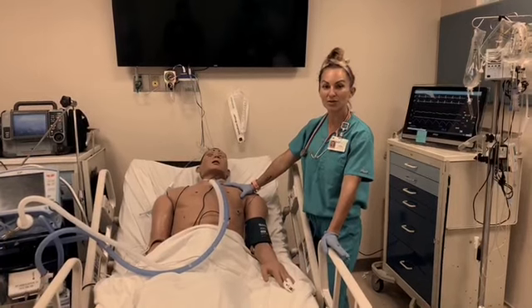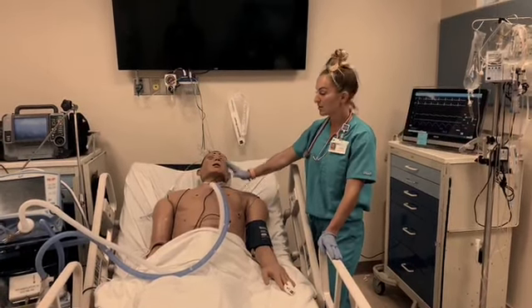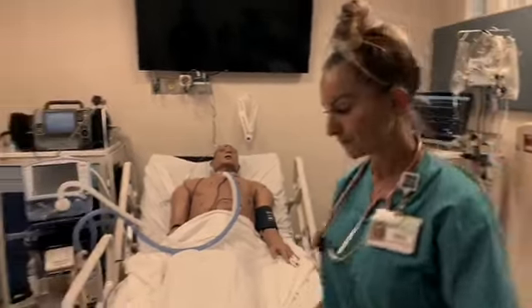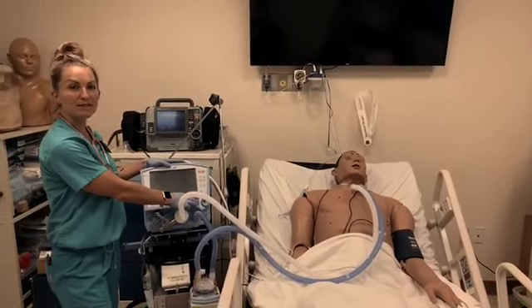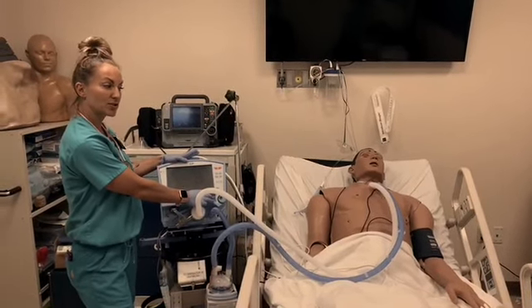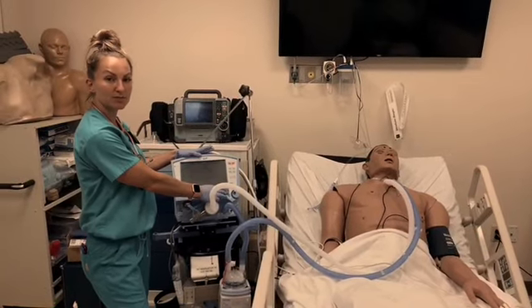How do we go about suctioning the patient? Well, first and foremost, you want to hyperoxygenate the patient. With the ventilator intact, you're going to walk over to the vent, push the button on the lower right-hand corner that says suction. What this is going to do is provide the patient with 100% oxygenation. This is going to hyperoxygenate your patient in preparation for suctioning your patient.